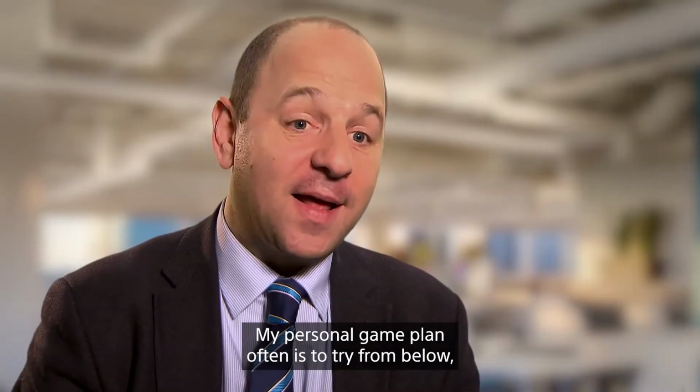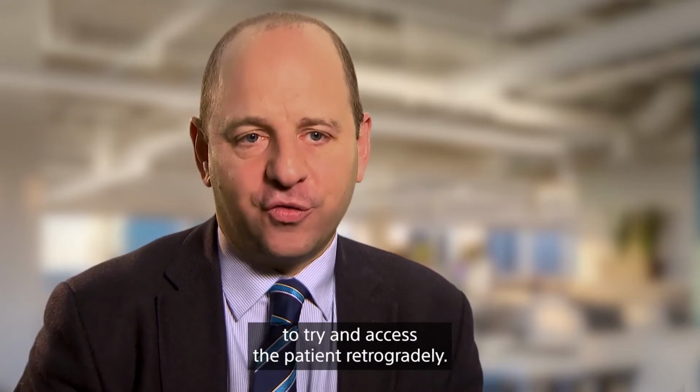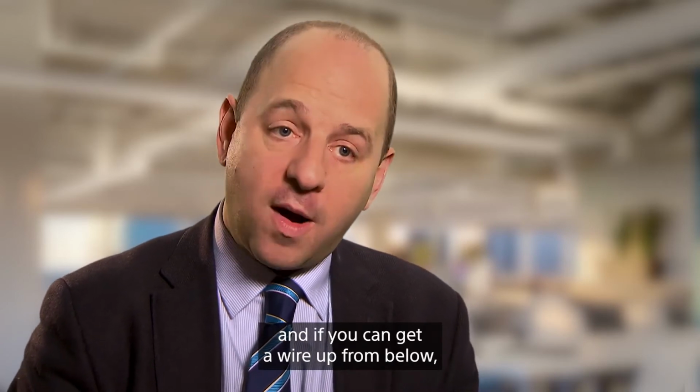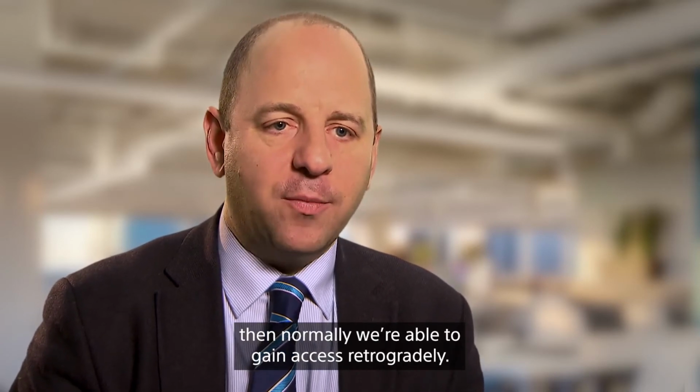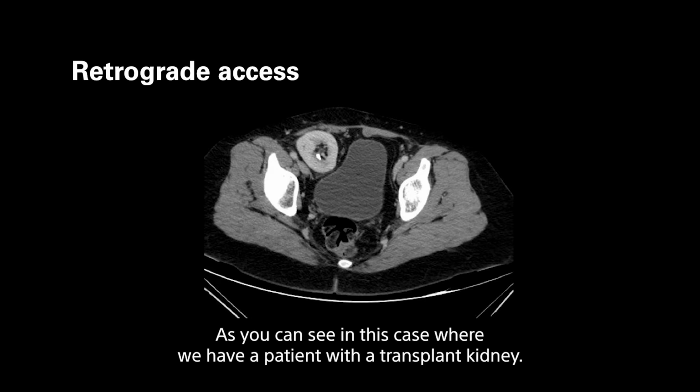My personal game plan often is to try from below, to try and access the patient retrogradely. So often you can get a wire up from below, and if you can get a wire up from below, then normally we're able to gain access retrogradely. It's certainly worthwhile trying a retrograde access in the first instance. As you can see in this case, where we have a patient with a transplant kidney.